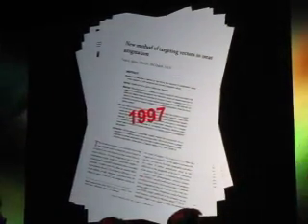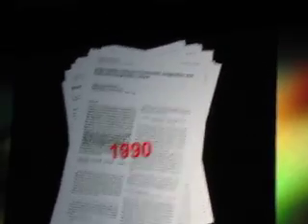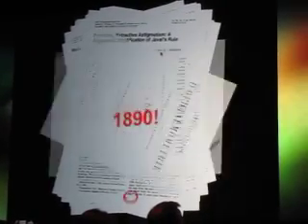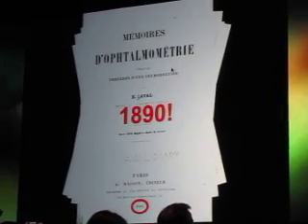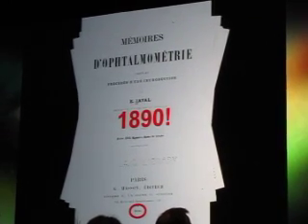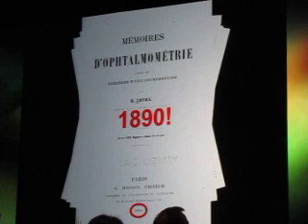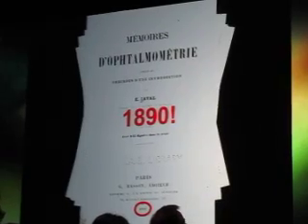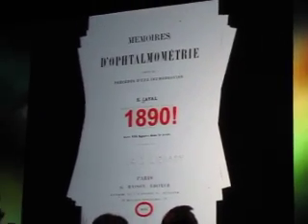Here it is in Singaporean school children. Here it is in 3 to 5 year old Hong Kong children. Noel Alpins implied it in one of his seminal papers. Here is another one, 1991, 1990, 1988, mention of Javal's rule. Javal's rule in 1890. Yes, 1890. Javal, unable to measure the posterior cornea, came up with a table in which you convert corneal astigmatism to ocular astigmatism, and you reduce it because of what he felt was against-the-rule astigmatism, and he surmised that it must be in the back surface of the cornea.